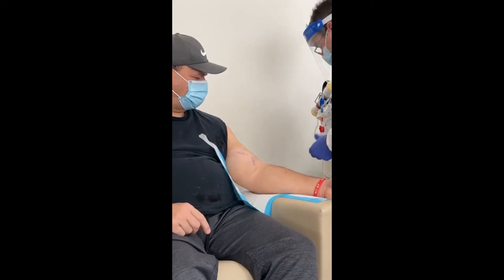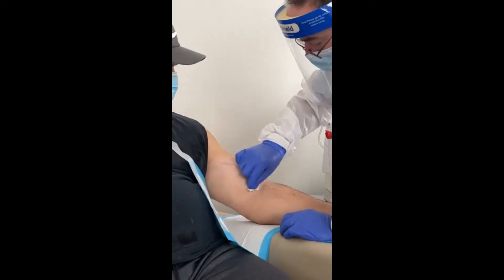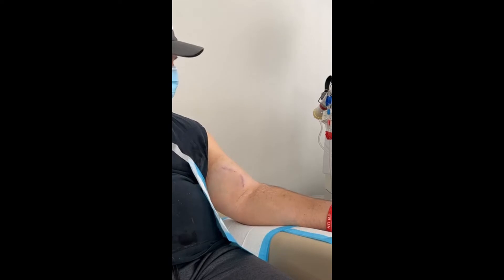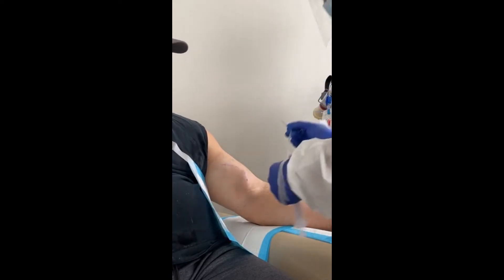We'll go ahead and put this needle in — you'll see how the wet stick works. Once it hits the vein, it's going to go through the tubing and you'll see it. I can identify that I'm in right away. It's an old school technique. It helps out when you have difficulty with an access. A lot of people ask us, what do you do when you have a difficult access to stick? Well, here's one of the tricks.